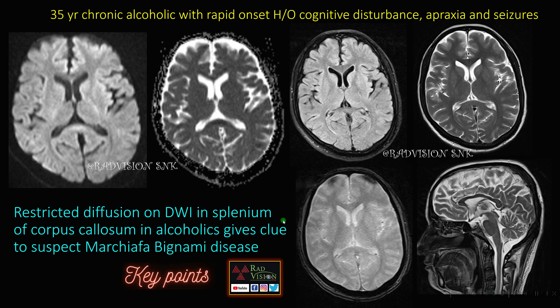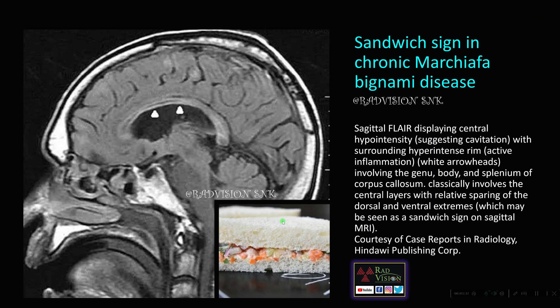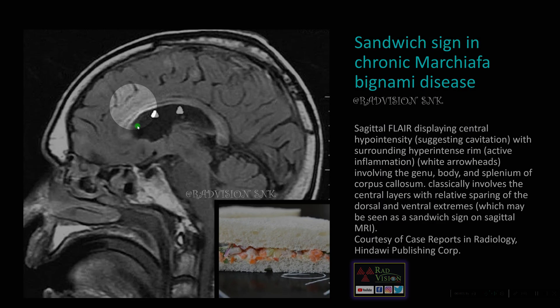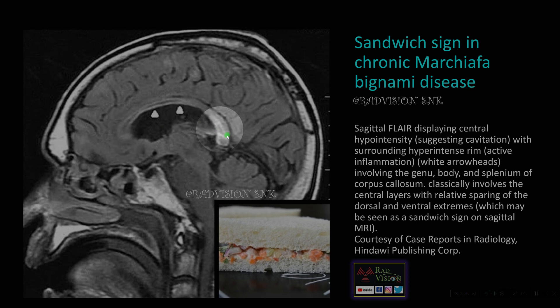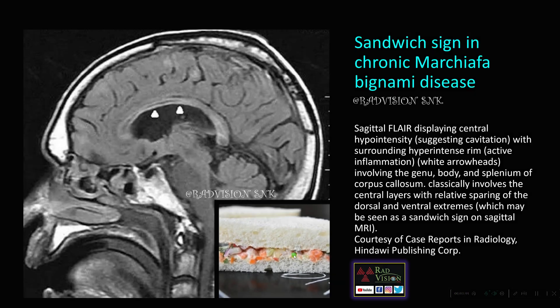Next: this is also a case of Marchiafava-Bignami disease but a chronic case. You can see there is cavitation and necrosis in the body and splenium of corpus callosum, but with sparing of the dorsal and ventral extremes. This gives the classical sandwich appearance. Remember the sandwich sign in chronic Marchiafava-Bignami disease.